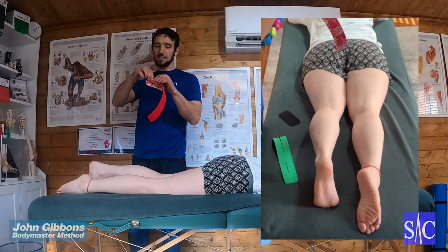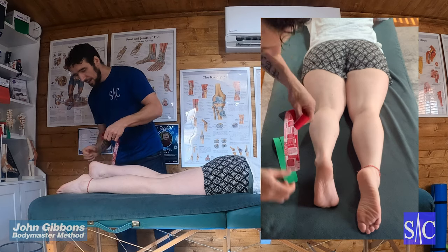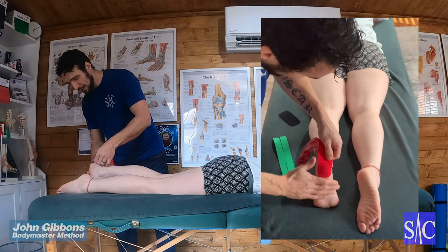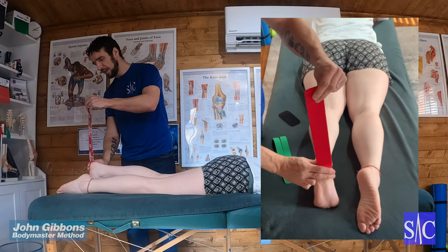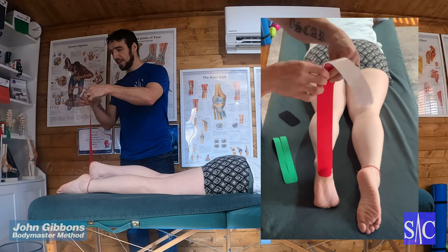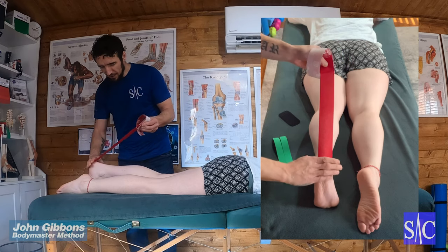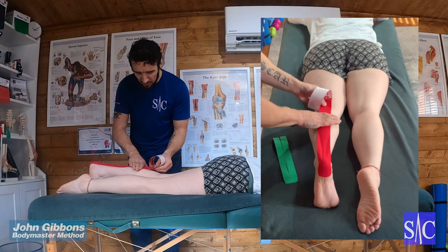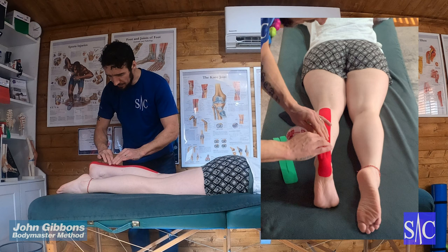For the first piece, remove about an inch of the backing and place the tape down on the heel. Secure with fingers, pull the tape so the backing comes away, and lay it down following the line of the tendon with little to no stretch at all, straight up the centre of the calf. Then smooth it over the tendon.